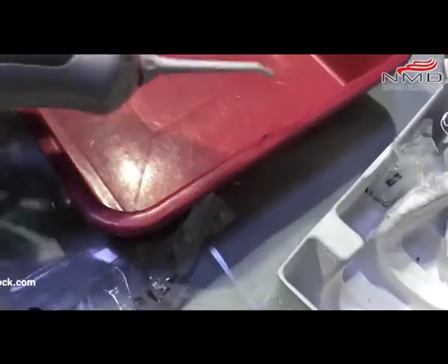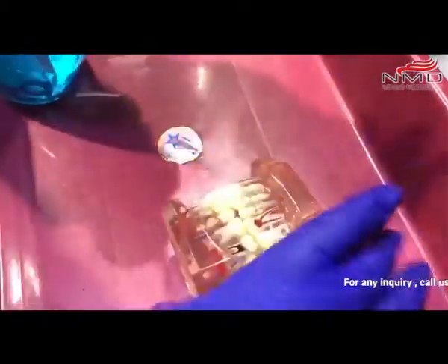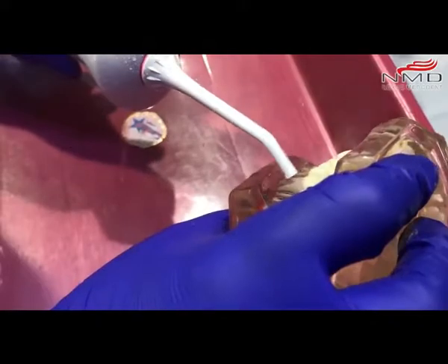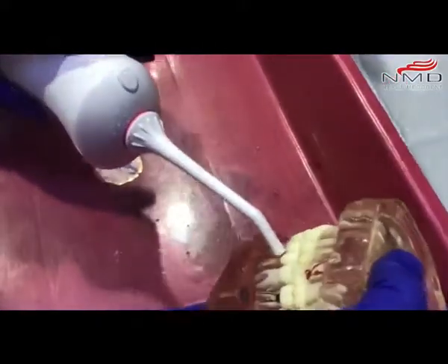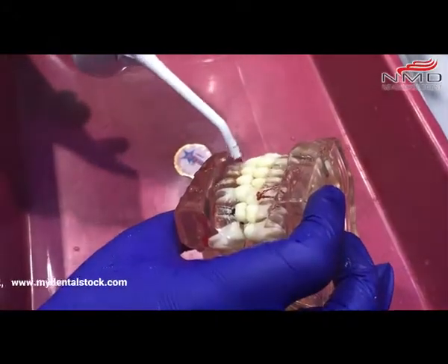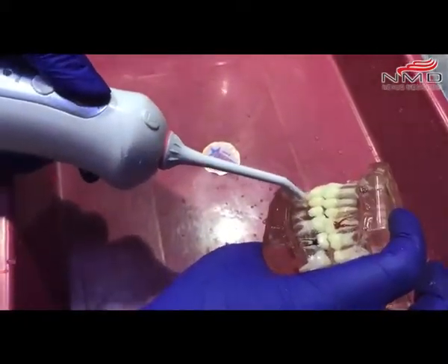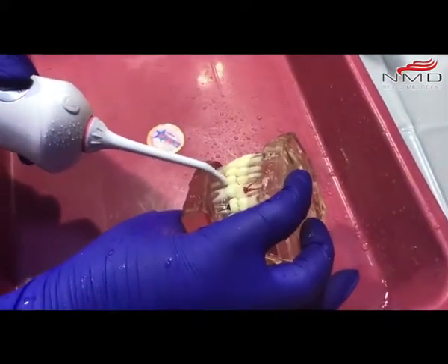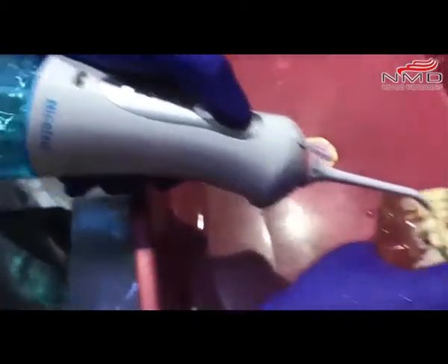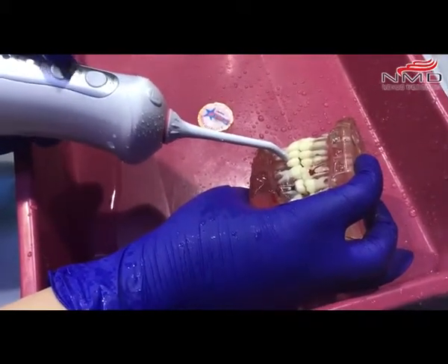We'll go for Soft mode because for girls it has to be a little gentle. It has to be at 90 degrees, like this. You can see the mode is on Soft. Let me change the mode — now this is Pulse. Now this is Normal.